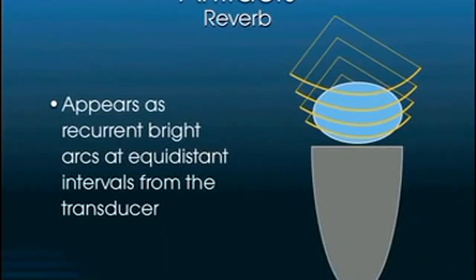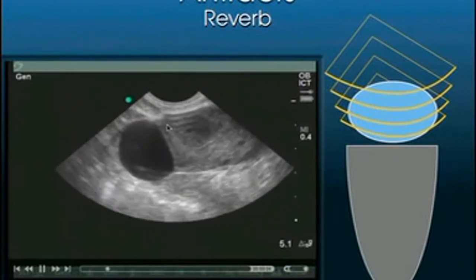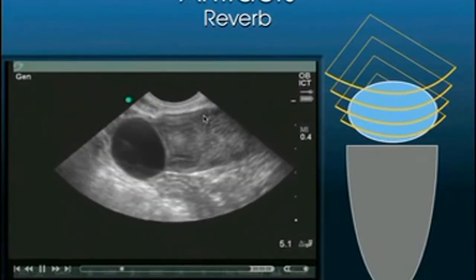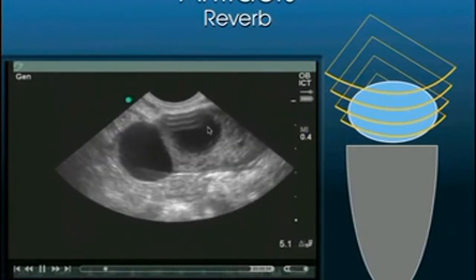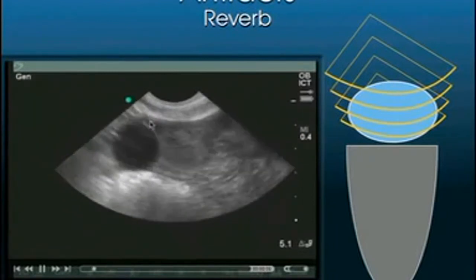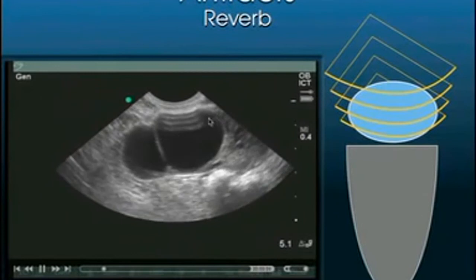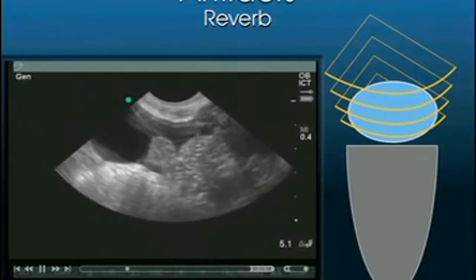Reverberation artifact appears as equidistant arcs from the transducer. These are seen commonly with curved or phased array transducers, and you don't want to mistake them for something anatomic or pathologic. For example, with an intracavitary transducer viewing an ovarian cystic structure, equidistant arcs appearing on screen are not a hemorrhagic cyst — they are simply reverberation artifact.